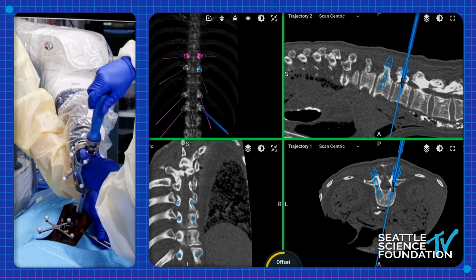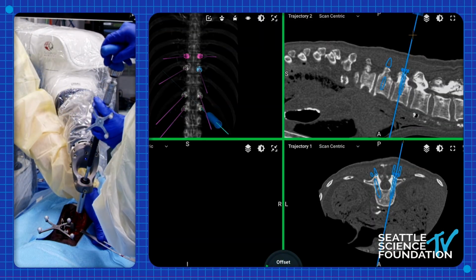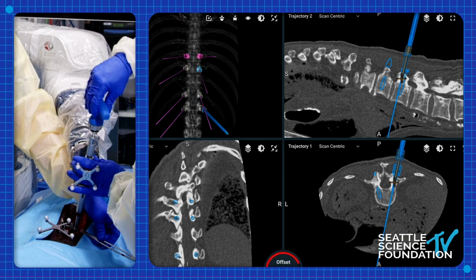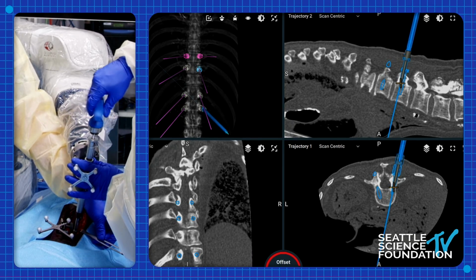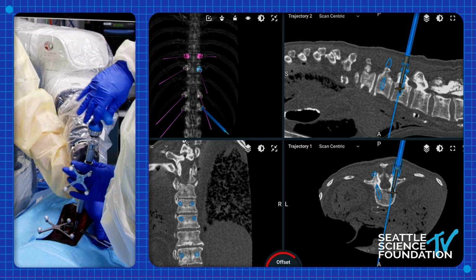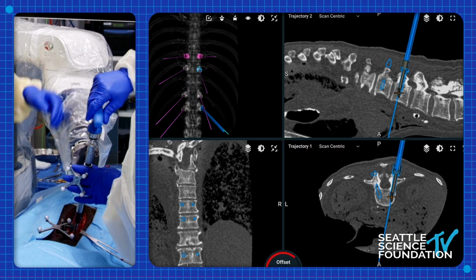these enabling technologies, the navigation, the robotics, and even AI can help us almost like bumpers, keep us from getting into the outlier cases. And that's been shown very effectively in the total joint population with the adoption of robotics. I think in spine, there's just a lot of variability, and that's why we're not seeing as consistent results like that in the literature. But I imagine as these continue to evolve and be adopted, that we'll see more and more of that.